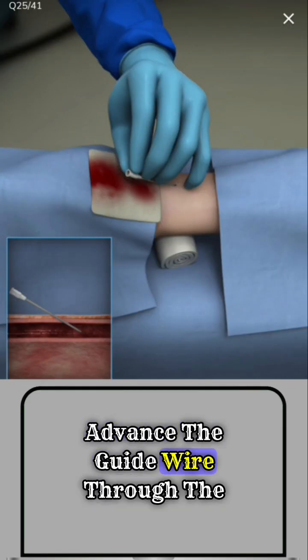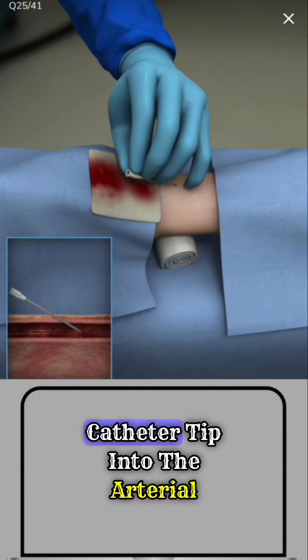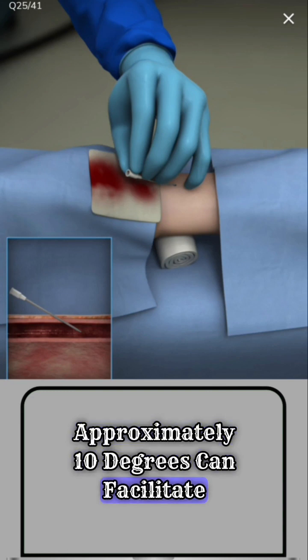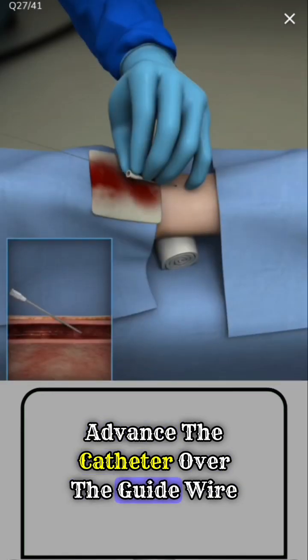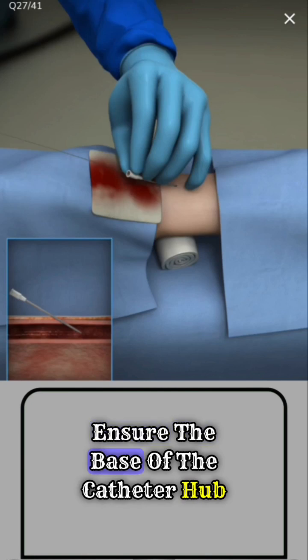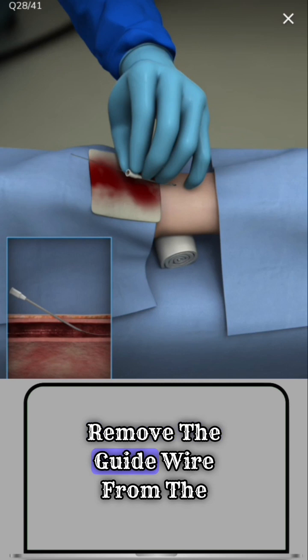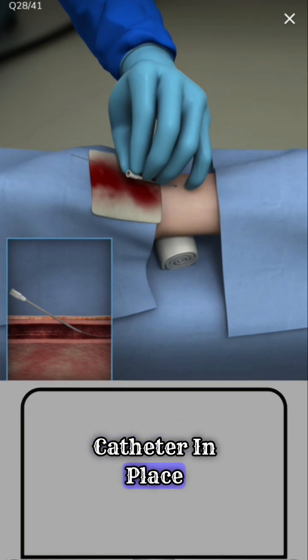Advance the guide wire through the catheter until its distal end has passed the catheter tip into the arterial lumen. Reducing the needle angle to approximately 10 degrees can facilitate guide wire passage. Advance the catheter over the guide wire and into the arterial lumen. Ensure the base of the catheter hub is at the skin. Remove the guide wire from the artery carefully, leaving the catheter in place.